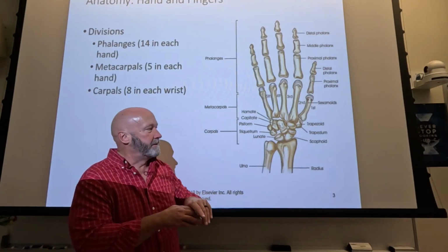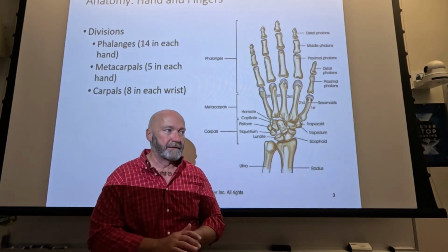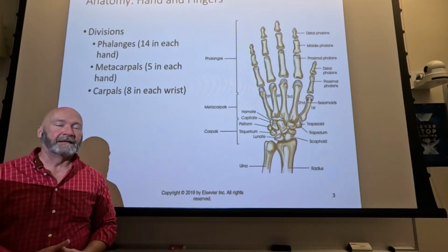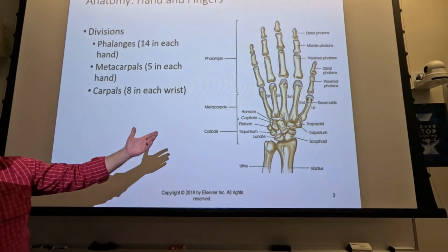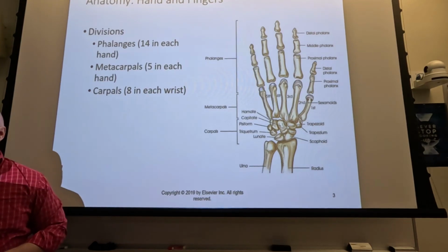A third of the radius and ulna is really for the wrist bones specifically, but you need to see the distal radius and ulna. Okay, so now it's just a matter of identifying what constitutes the middle of the anatomy. And sometimes it's pretty specific. So looking at that, what would be pretty much right in the middle of that diagram?